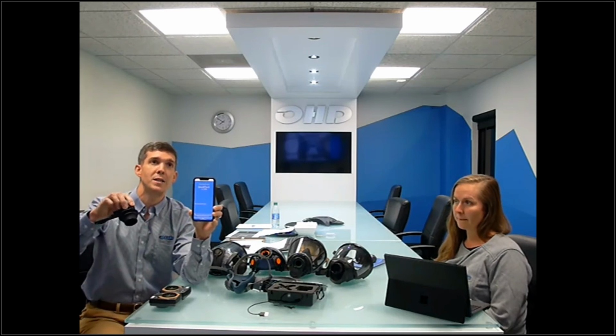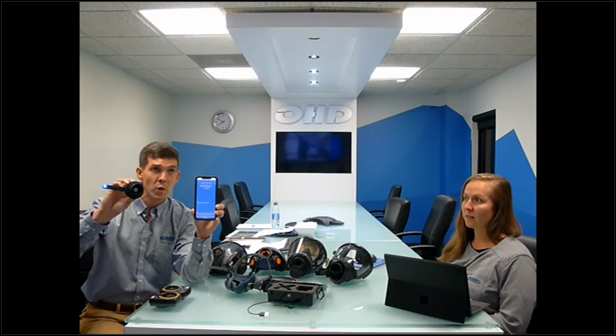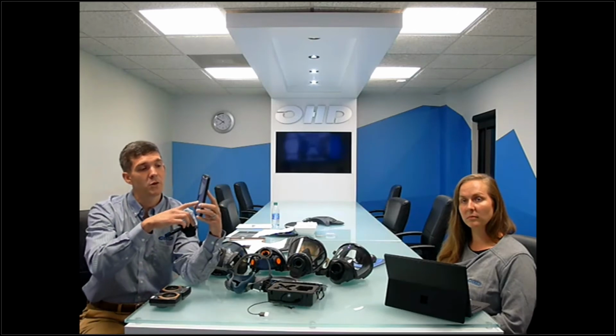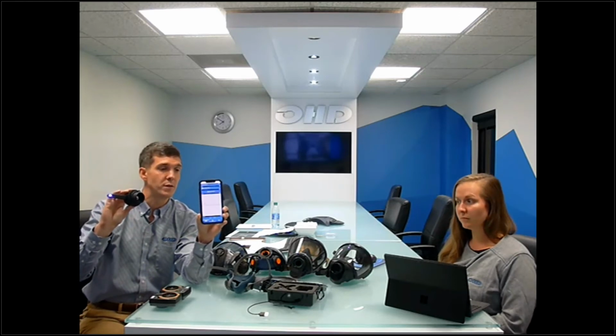So button on the side to power on the device. What you'll see is the device will auto-calibrate itself, and then it will begin to give me a slow pulsating light to let me know that it's ready to test. Now you've seen on the app, the device is now discoverable. So if I touch it, it will launch the app and connect to this device so I can do a fit check there. So everything's ready. So the app is now seeing the device. It's now waiting for me to do a fit check.